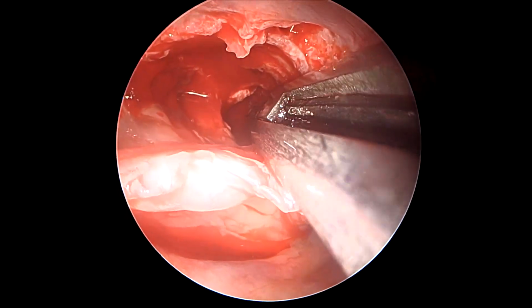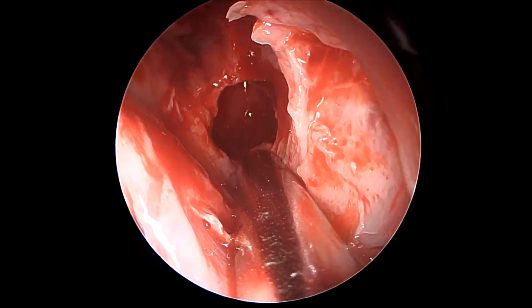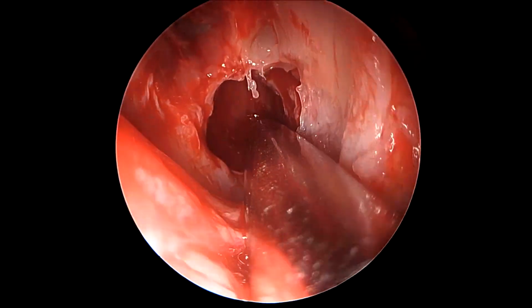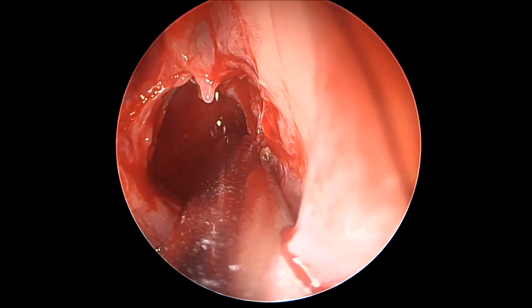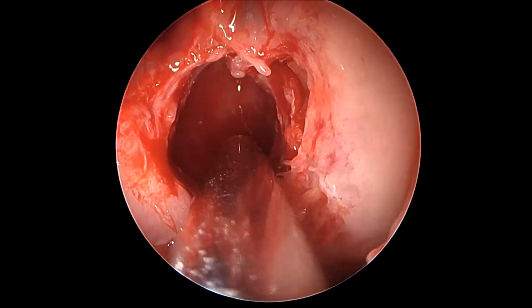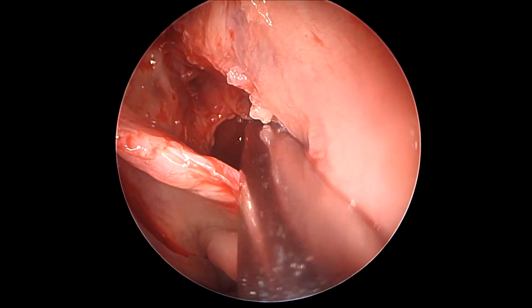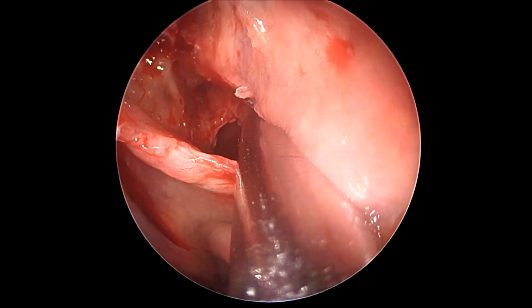So we normally use the bone punch because it's a very robust instrument. Otherwise, for more fine work, one could even use a straight mushroom punch, but mostly it just breaks quite easily when encountering tough bone. So we generally use the upward facing straight bone punch, and you can also turn it downwards and laterally to be able to conclusively clear more bone of the sphenoid sinus walls.